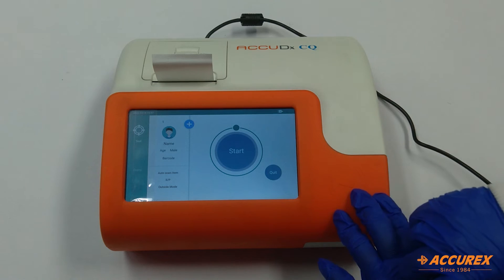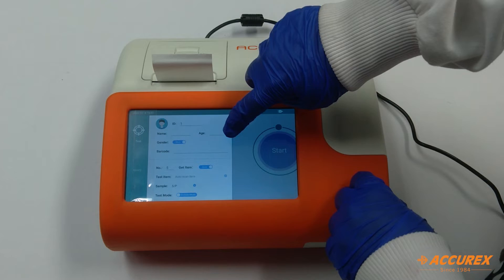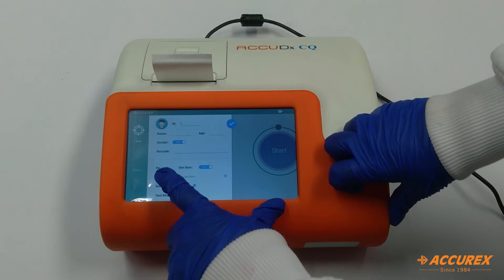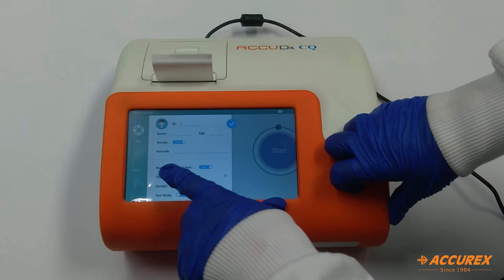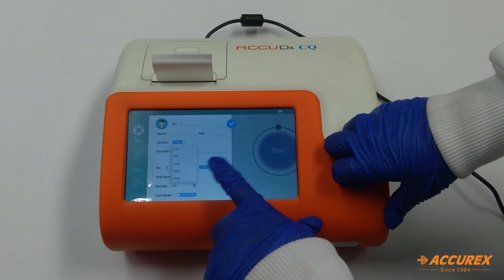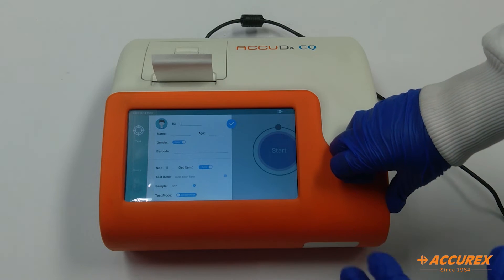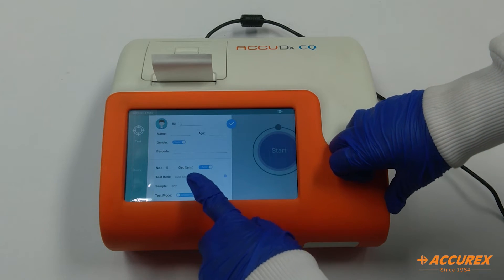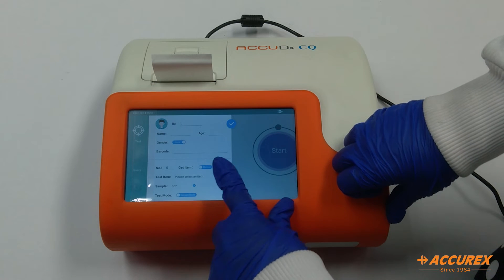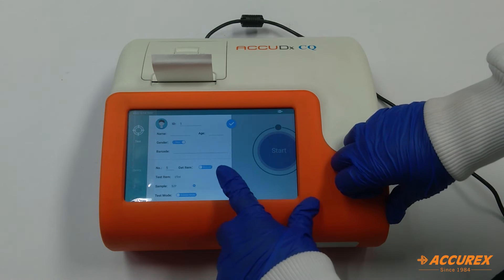The first option is the test option. From here you can add the patient name, gender, age, and barcode. Here it shows the test number — how many tests we have performed on this analyzer. From here it's the get item, so what test you are performing. This is the test name; you can either scan or manually select it — for example, cTnI, or whatever test you are performing.